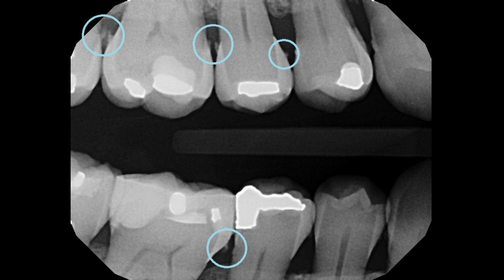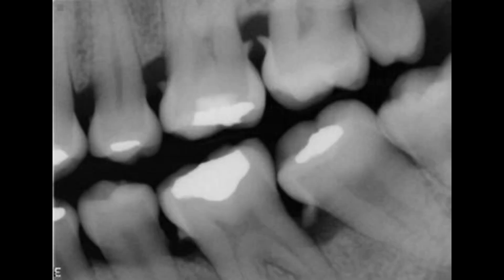In this next image, we see some more tartar. It's circled in blue, just another example. And then this next image is some pretty significant tartar. We sometimes call these spurs. I use the term tartar and calculus interchangeably, and like I said, we reference it as deposits, barnacles, spurs that we see on these radiographs.